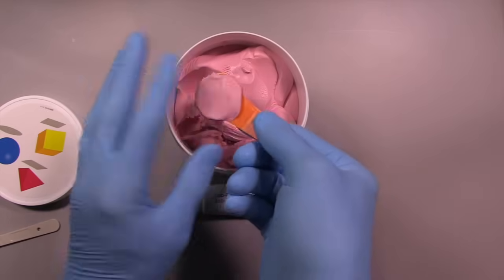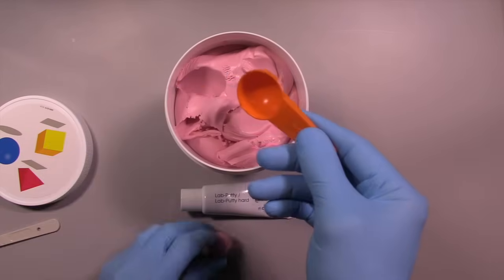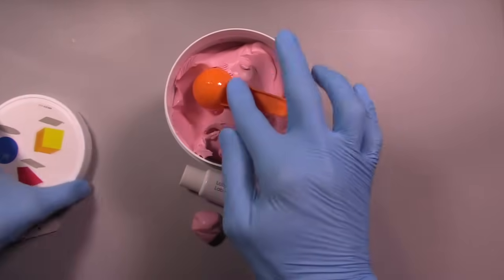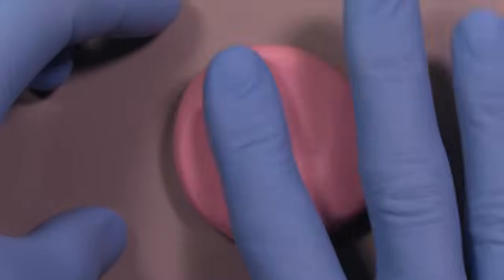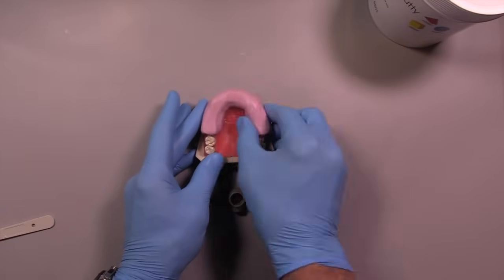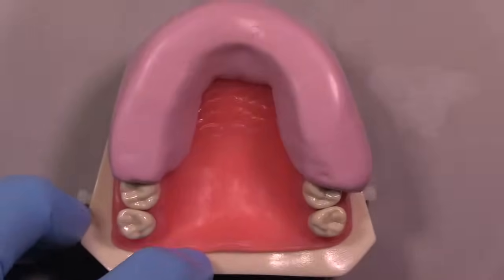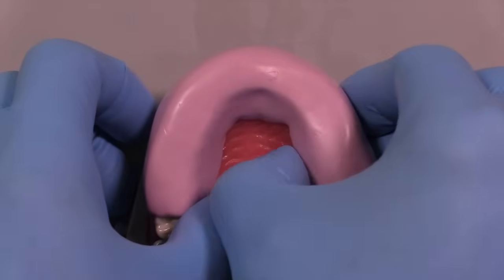For most maxillary cases, two scoops is going to be more than enough — it's better to have a little extra than not enough. We'll take out a fairly level measure of the product, two scoops, then add the catalyst to it and mix it up. We're going to mix them into a little ball, flatten it out on the tabletop, one little stripe across, and mix with your gloves. You don't want to do this with your gloves off because the material can get into your fingernails and discolor your fingers for a long time. We wrapped it over the teeth in a manner which went from the facial to lingual — we don't just plop it on top.